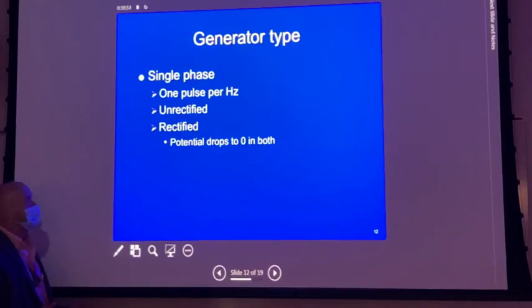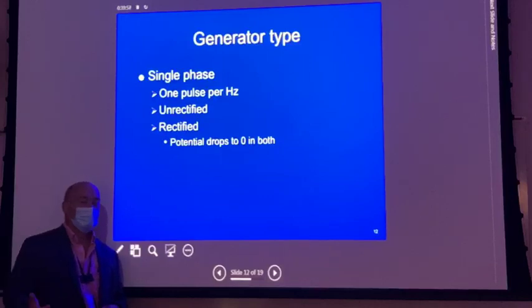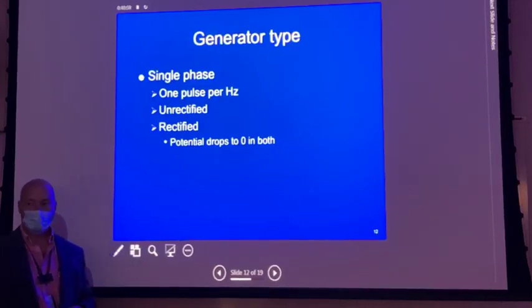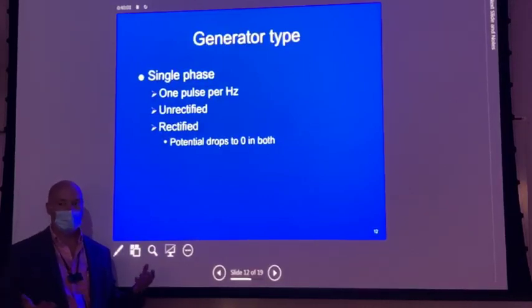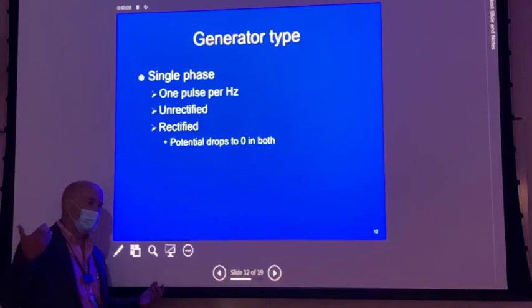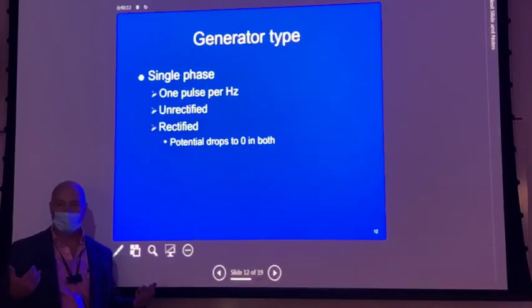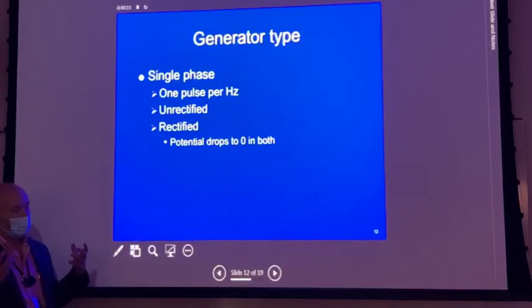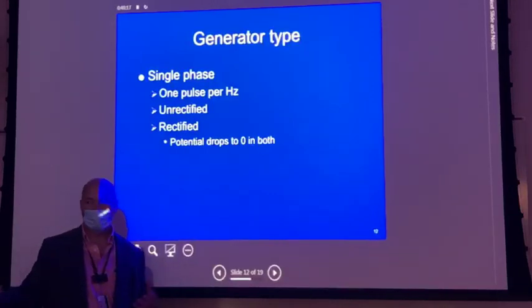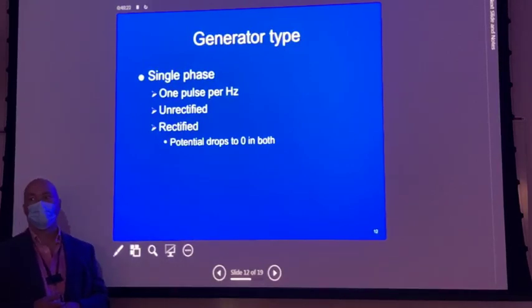And what we say about unrectified units is that they are self-rectified. Remember, the x-ray tube is not only a big light bulb, but it's also kind of like a big fuse, right? It's a vacuum tube diode, so electrons go from one end to the other, but it's unlikely they're going to come back across the x-ray tube, except where we use extremely high voltage. So what kind of voltage do we use?